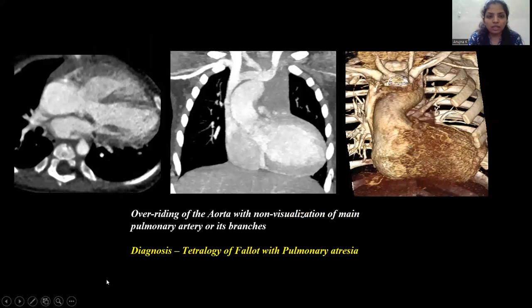The following axial and sagittal contrast-enhanced CT images show overriding of the aorta with non-visualization of the main pulmonary artery or its branches. This was a case of tetralogy of Fallot with pulmonary atresia.